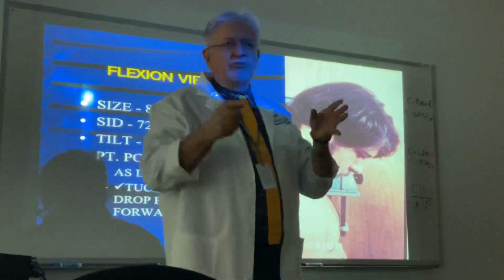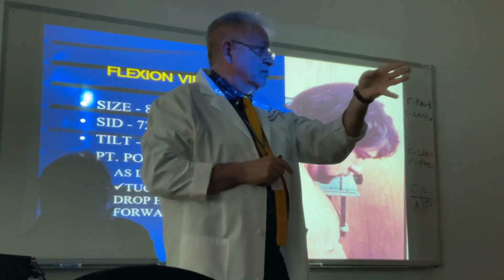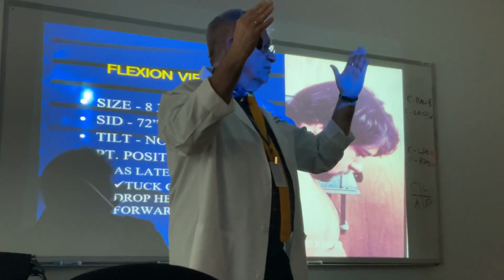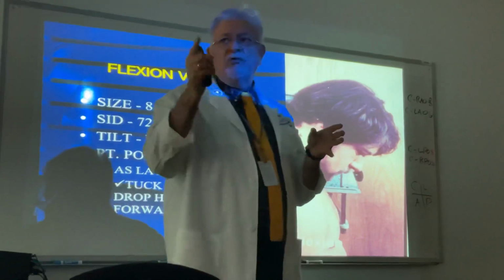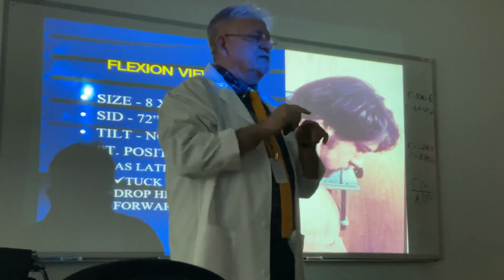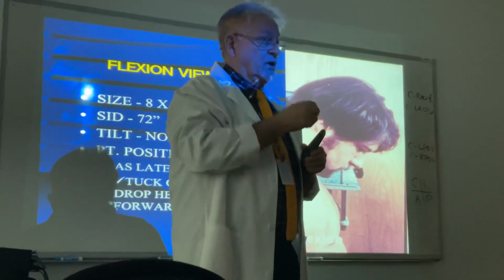So everybody in this room except Dorian, I'd have to make that area exposed bigger, but his spine is still in the middle, so I can probably get away with it. Everyone else will fit onto the clipboard size. It's your responsibility to put their spine in the middle, okay?